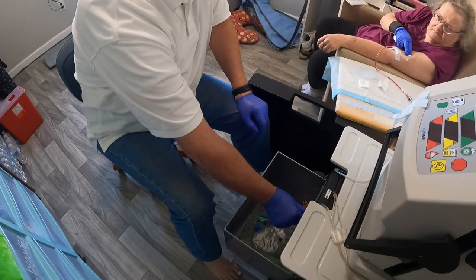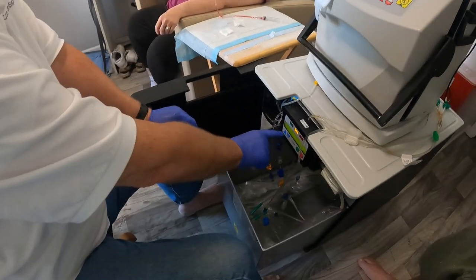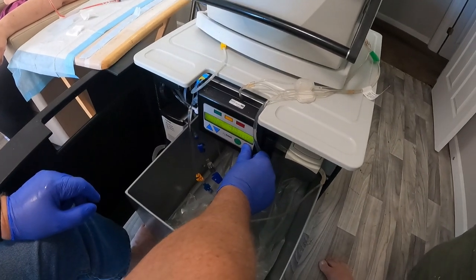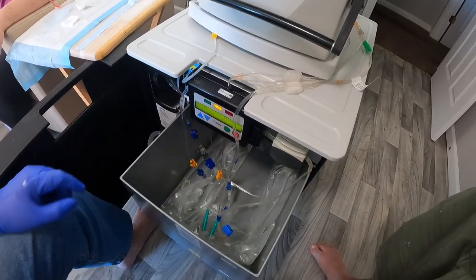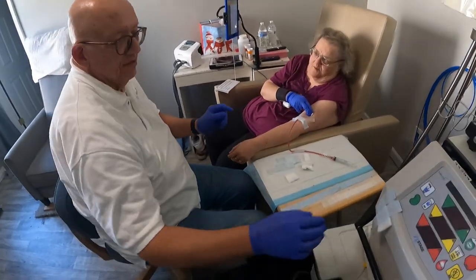It says paused. I hit stop again, and I get that same menu: more, go, done, stop. So I'm gonna say done. Okay. It's gonna say flushing. While it's flushing, we come over here.